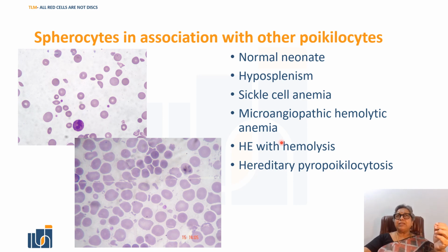So looking at the smear, once you pick up the main poikilocytes, you also look for the associated cells, and only then will you be able to arrive at a diagnosis.